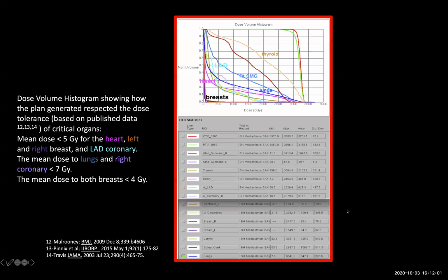So then when you look at the DVH, you find all the organs that you're interested in come on the left side of your DVH. Part of the LAD, which is the beginning of it, might get into some high dose at the V5 and the V10, but still we have to remember that the 5 gray and 10 gray are being delivered over 3 weeks. So on a daily basis, you're getting less than 1 gray to the LAD, and that will prevent it from having the same bad outcome that has been reported in the literature at the time when we used mantle field or cobalt.